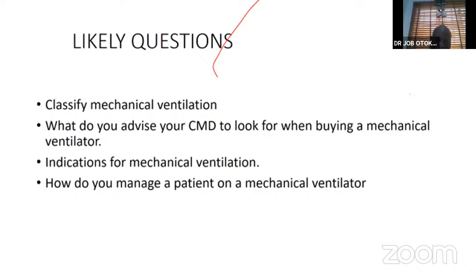it becomes a big problem. Indications, we talk about indications, primarily respiratory failure, type 1, type 2, type 3, and then coma and the rest. And then how do you manage the patient on the ventilator?